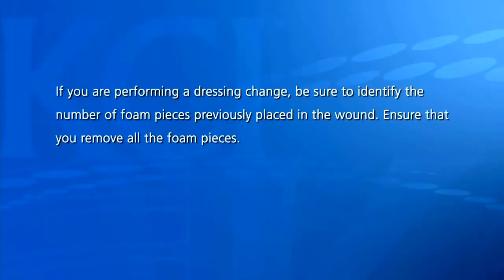If you are performing a dressing change, be sure to identify the number of foam pieces previously placed in the wound. Ensure that you remove all the foam pieces.